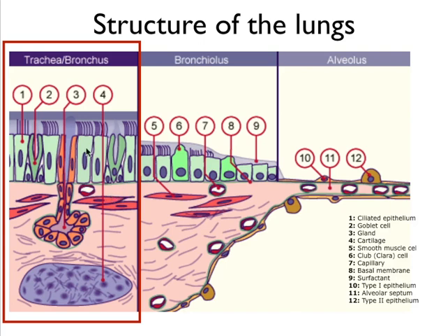In between these ciliated cells and goblet cells you also see these smaller cells, and those are called basal epithelial cells, and these are the progenitor cells of the ciliated epithelium. So if your ciliated epithelium is damaged and you need new ciliated epithelial cells, these cells will start to proliferate and differentiate into ciliated epithelial cells. All of them are situated on this thin green line, which is called the basement membrane.